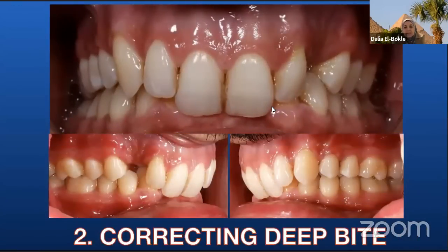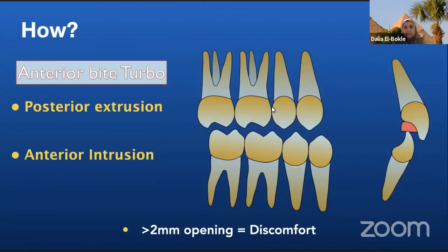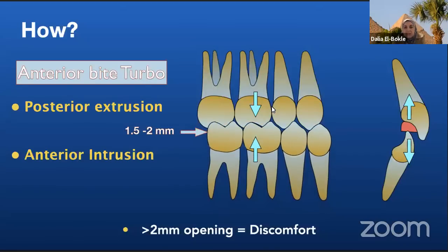So the second indication for disarticulation is deep bite correction. Anterior bite planes can be very useful in correcting deep overbite in growing patients, since they provide vertical clearance, reduce muscle hyperactivity, and permit extrusion of the buccal segments into the excessive freeway space. Posterior box elastics can be used to effect the extrusion of posterior teeth, incrementally increased if desired.